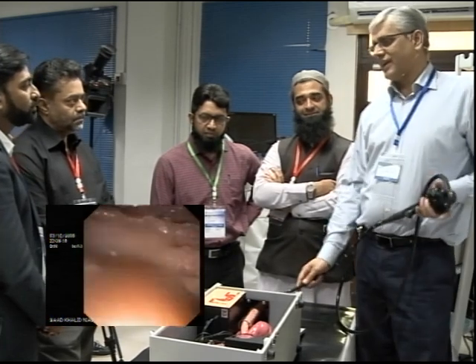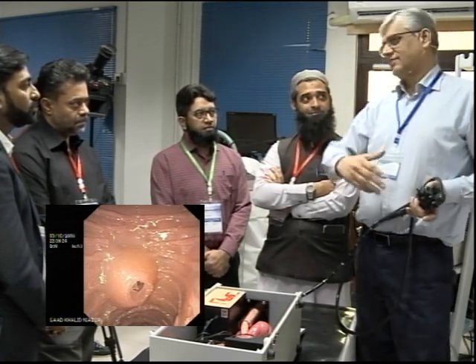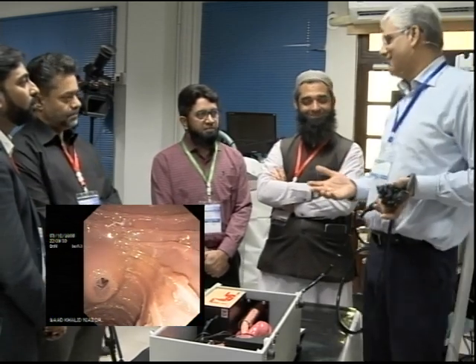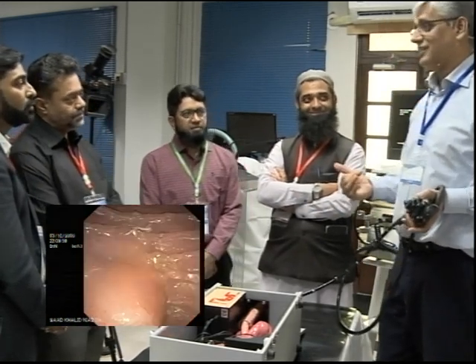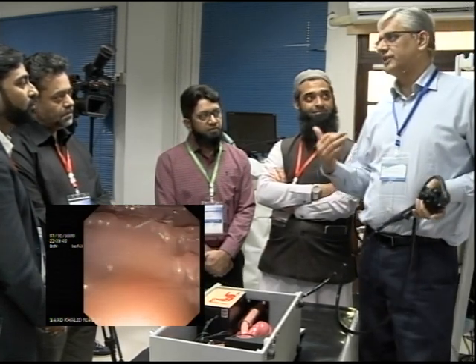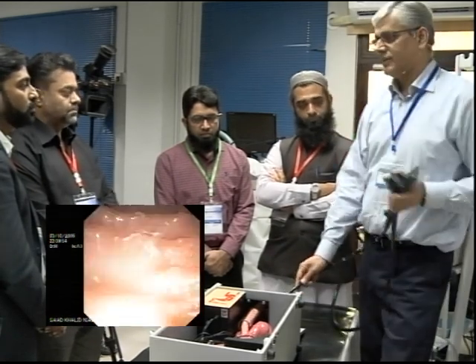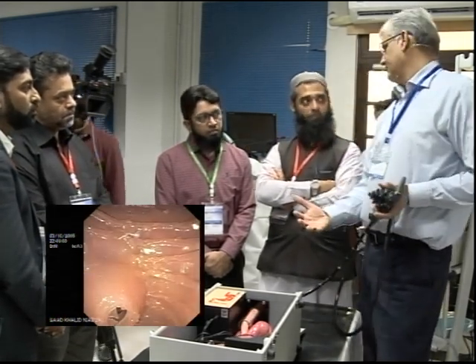Like you said, when we talk about stenting, they have no issues. Their scopes are replaced regularly, and if they break the elevator, it's not a big deal. They will have another new scope or a replacement. We have a big problem. A lot of centers here only have one or two scopes. And so I avoid using the elevator for putting stents as much as I can. I use this, this, or this. This also works. With the combination of the three, in difficult cases, sometimes you have to apply all three.